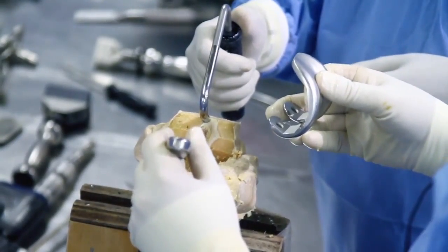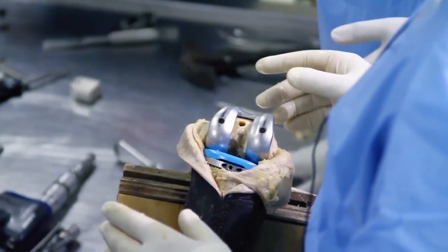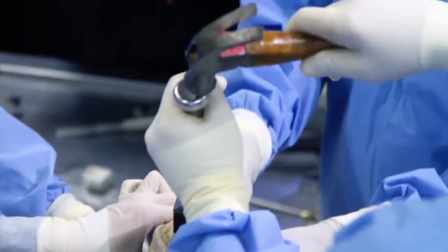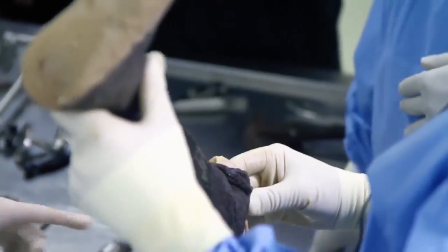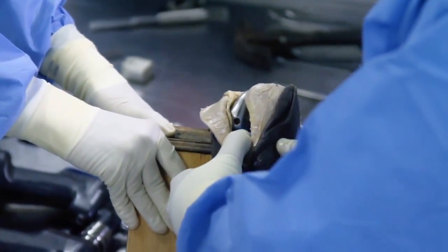Pain. Now, here. And now equal extension. The collateral ligaments are still intact. We haven't damaged them. We've gotten rid of the cushion.